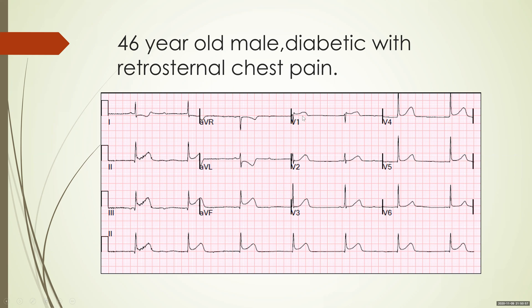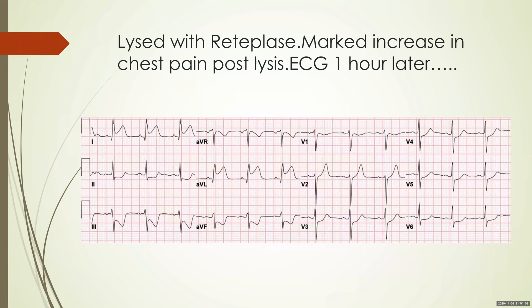With an RVMI, you can localize it to the proximal RCA — so it's an inferior wall MI with RVMI due to proximal RCA occlusion. This patient was lysed with reteplase, probably because the hospital did not have a cath lab, and the patient complained of a marked increase in chest pain post-lysis. This is the ECG taken one hour later.